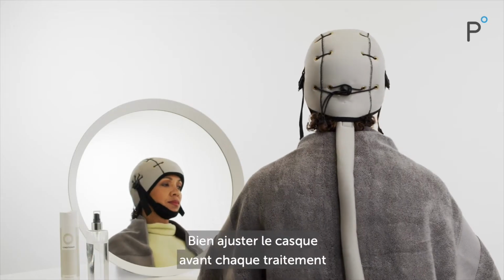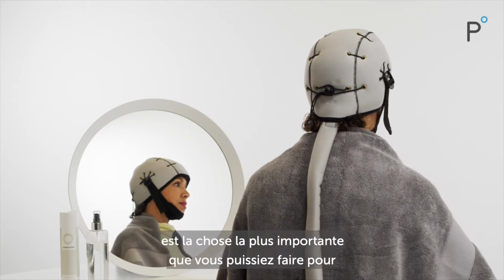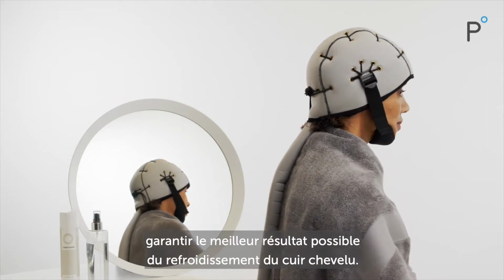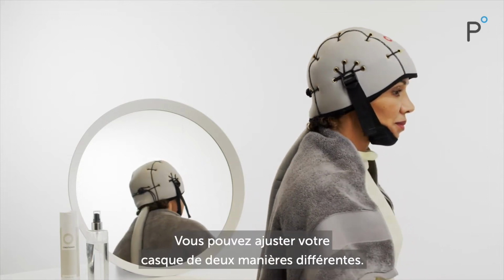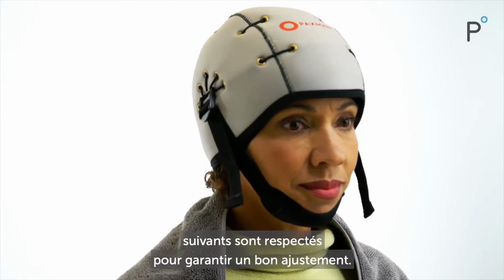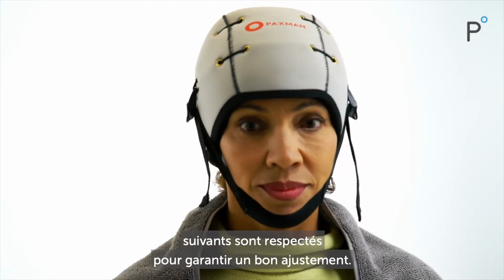Getting a good cap fit before each treatment is the most important thing you can do to ensure the best possible outcome from scalp cooling. There are 2 different ways in which you can fit your cap, but whichever you choose, you need to make sure that you achieve the following to ensure a great fit.